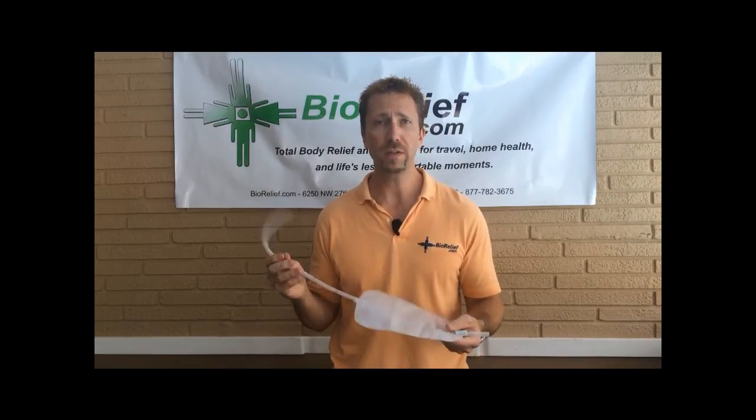Hello, my name is Jeff with Biorelief.com and in this video we're going to highlight the new leg bags that are coming in with the Stadium Pal kits. Coloplast, who is the manufacturer, had to discontinue the older version we were using and replace them with these newer ones.